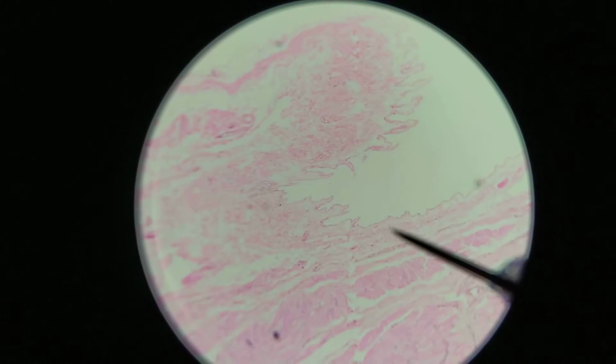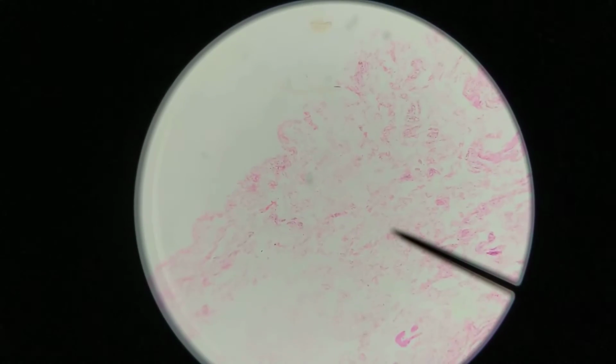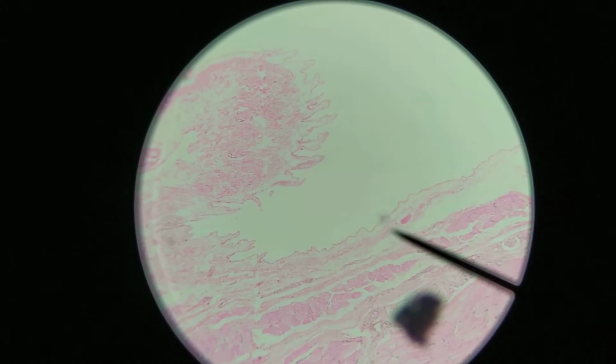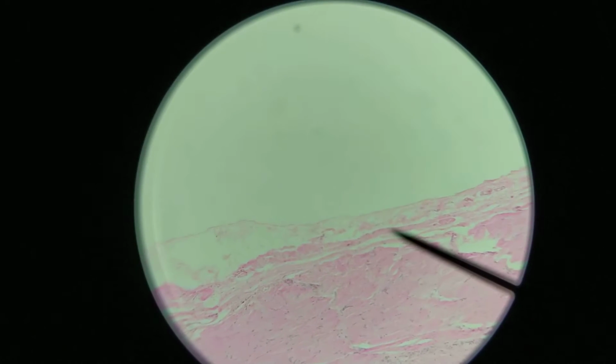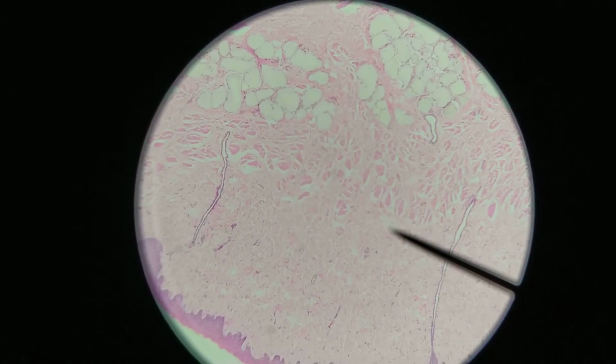Whereas a little further up, this was the upper portion of the esophagus. We have the tunica adventitia, which again connects the esophagus to other parts of the body, and that starts to end right around here where we start to see a tunica serosa show up. Okay, so we're getting closer towards the middle portion of the esophagus here. Again, the muscle in the tunica muscularis is going to start to transition over. Right now it's still skeletal muscle or striated muscle, but as we go deeper, it will turn into smooth muscle instead.